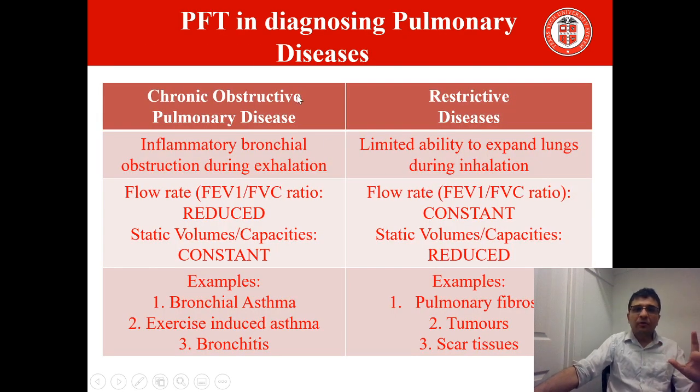Now, our last topic for today is how PFT helps us in diagnosing pulmonary diseases. We will talk about obstructive diseases, the COPD, and the restrictive diseases. Now, I have highlighted the big differences between the two in this slide.